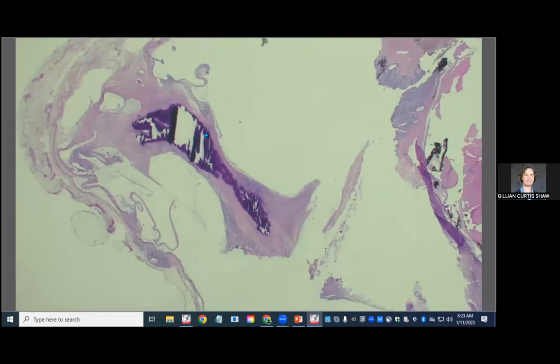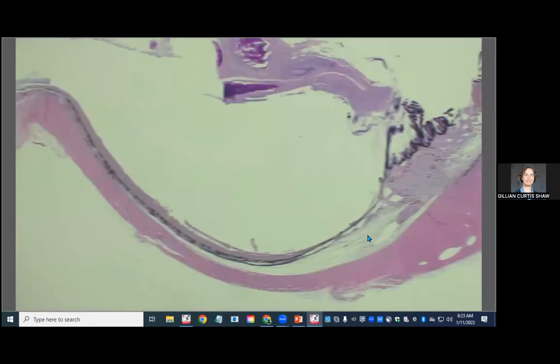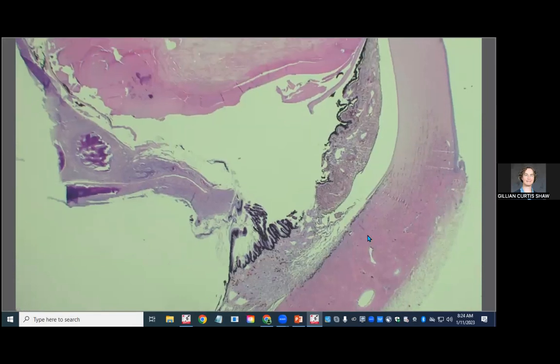And then how the eye forms is at some point ectomesenchyme kind of invades the optic cup. And so we assume that a lot of this sort of disorganized mesenchymal tissue with the bone and things like that is probably just that mesenchyme that's supposed to come in and form the structures that we recognize, getting lost and forming all sorts of funky stuff instead of what it was supposed to form. So basically just an embryologic congenital malformation, a constellation of findings like that, and a nice sort of better formed side to compare to, which was kind of neat.